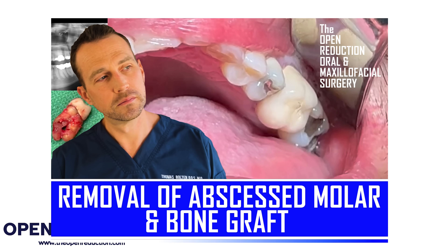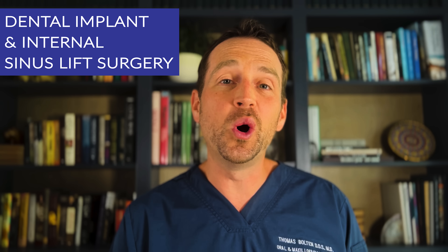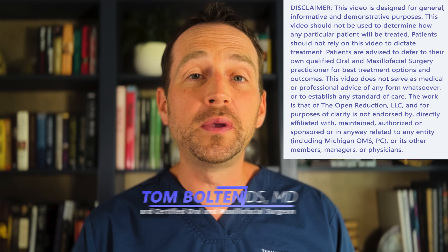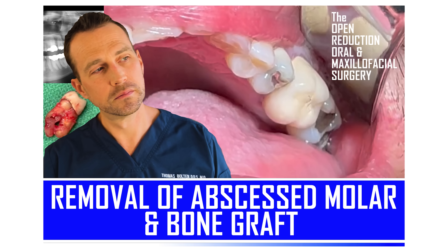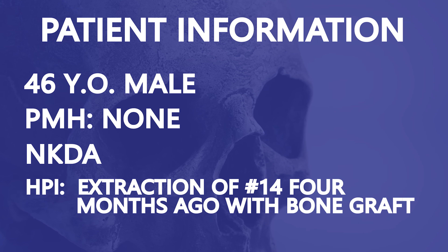A 46-year-old male who's been featured on the channel before is hoping to replace a missing molar with a dental implant. Welcome to The Open Reduction, your channel covering all topics in oral and maxillofacial surgery. I'm Dr. Tom Bolton, and today we are performing an internal sinus lift and placing a dental implant in the left maxillary molar site, tooth number 14. This is actually part two of the treatment of this patient. I originally posted the full extraction and bone graft surgery video several months ago. The area has healed and it's time for a dental implant workup.